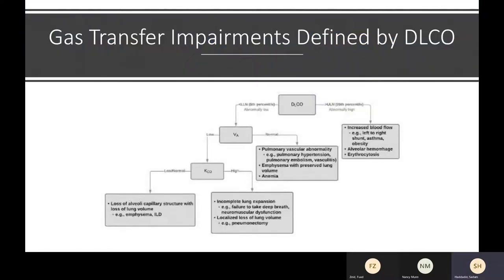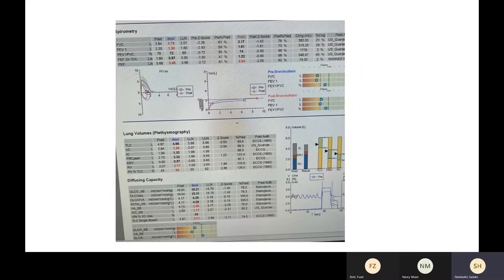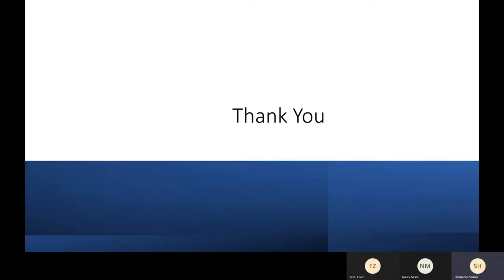FEV6 is not contained in the GLI also, and inspiratory capacity, those 3 points are just for future research. Inspiratory capacity could be used later on with the obstruction as it is. It can affect COPD or obstructive patients with dyspnea and exercise intolerance. Also the slope of the flow-volume loop can detect some obstruction if it's not detected by FEV1 or FVC. And some non-invasive techniques like oscillometry, usually used with children and young age, depend on the wave for the bronchus.